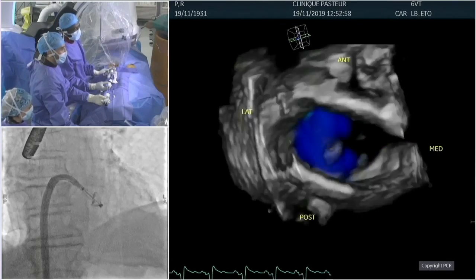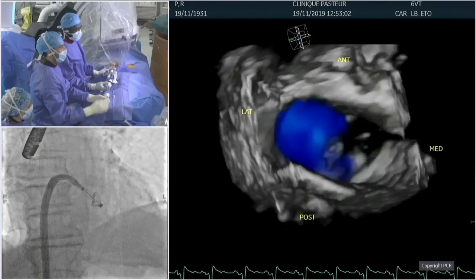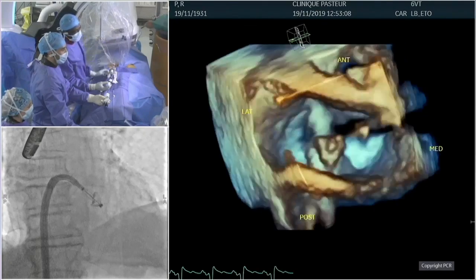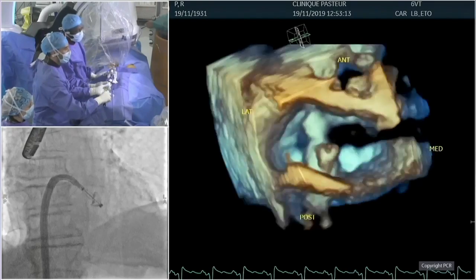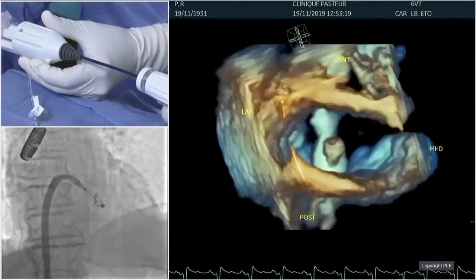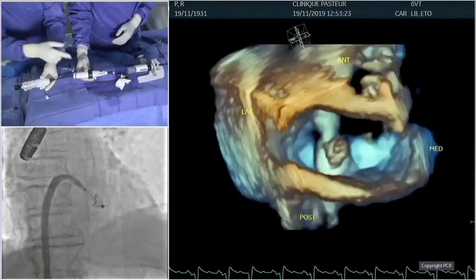Looks good. And regarding the angulation, what do you think? The angulation, I guess we are not that bad. Without color, you can skip the color. Yeah, I think you have to rotate a little bit the IC, just to be a little bit more perpendicular. Yeah, clockwise. Sorry, yeah, clockwise. So Didier, I'm doing this. What do you think about the trajectory? It looks a little bit more towards the posterior leaflet, so maybe we have to change the trajectory a little bit.